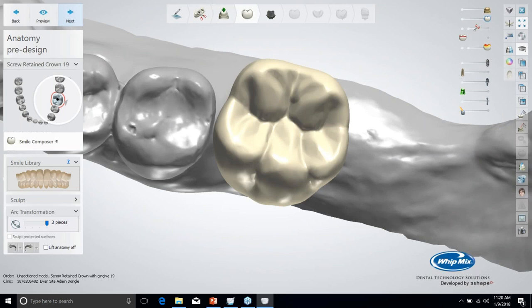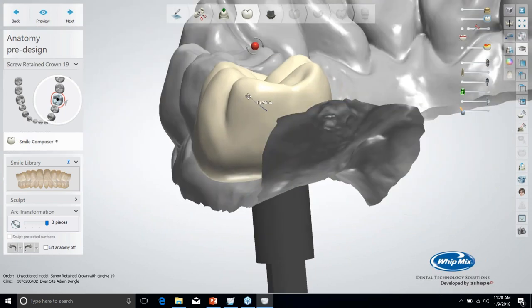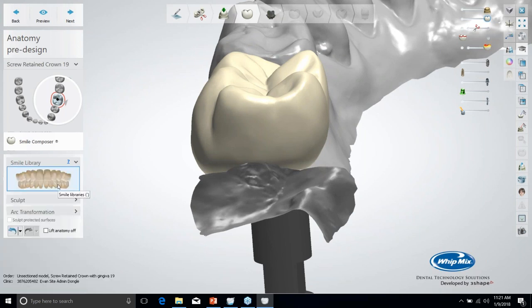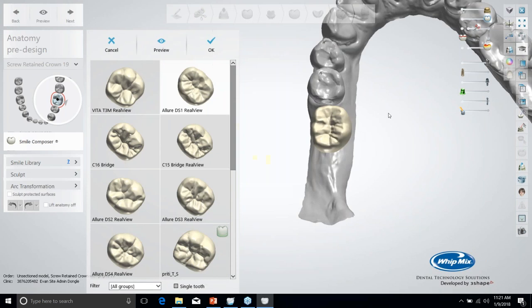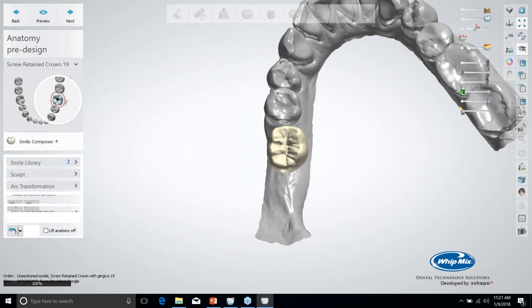Now if you're doing a screw retained crown or an anatomical abutment, then you'll have an anatomy pre-design stage. And what we're doing here is a basic design of our anatomy. We have all the tools that we would normally have if you're familiar with 3Shape for sculpting full contour crowns. You also have your smile library option where you can change which tooth you want to use simply by clicking on it. We could also mirror the tooth from the other side, but we're going to just pick a library tooth for this.